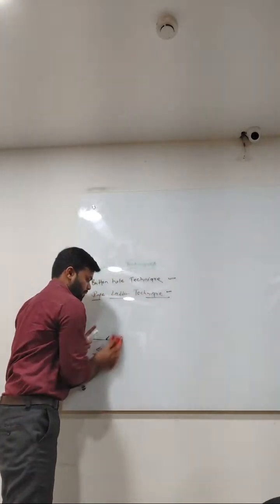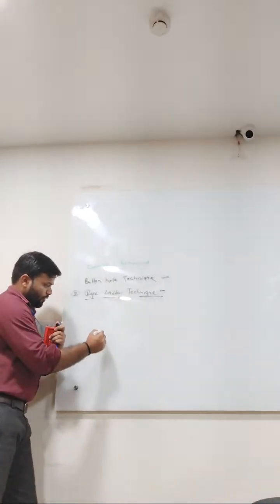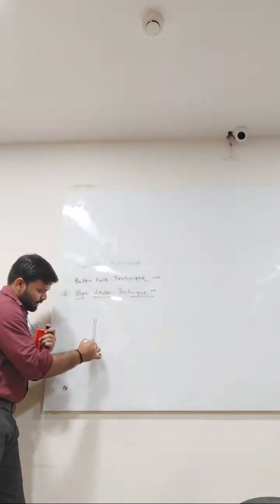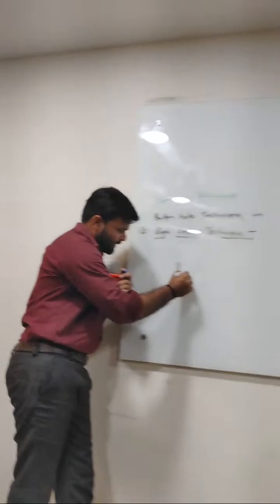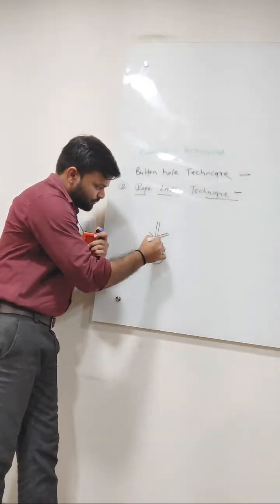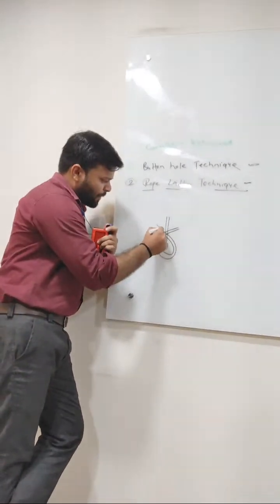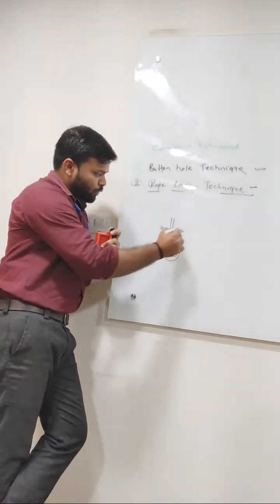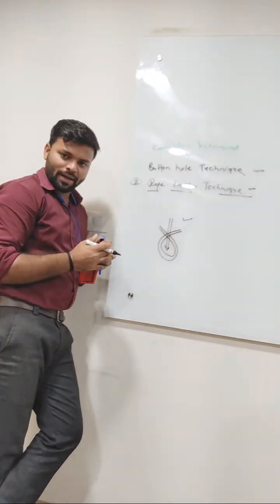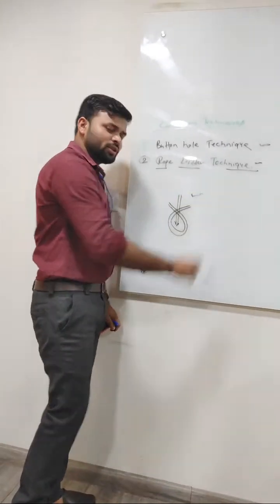Now we will tell you the technique of how to secure the needle to get a proper flow. If this is a needle inserted in the patient's arm, it has to be properly covered in this manner. This is known as the chevron technique, also known as the butterfly technique. Many people say chevron technique or butterfly technique. It secures the patient's needle in the arm properly and avoids blood loss during the hemodialysis. So always use the chevron technique during fistula cannulation.